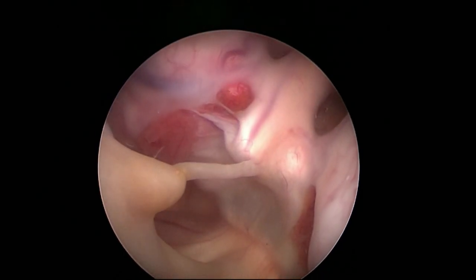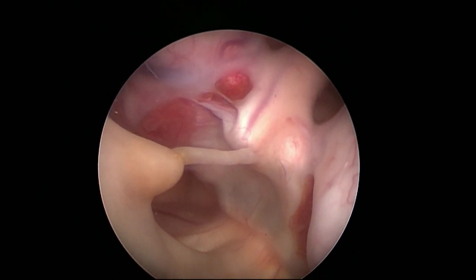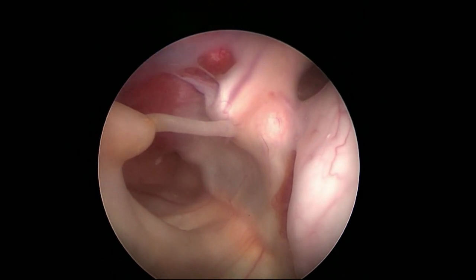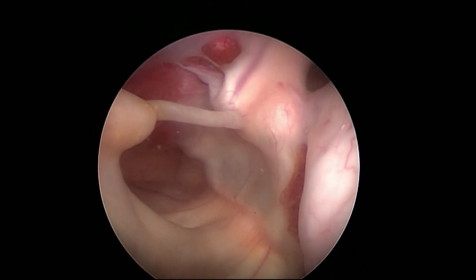A right precoronal access point is created. The endoscopic inspection shows a cyclops ventricle with aplasia of the septum pellucidum.